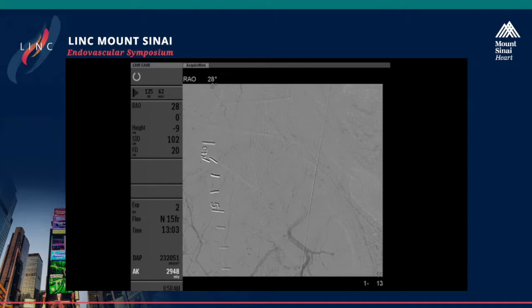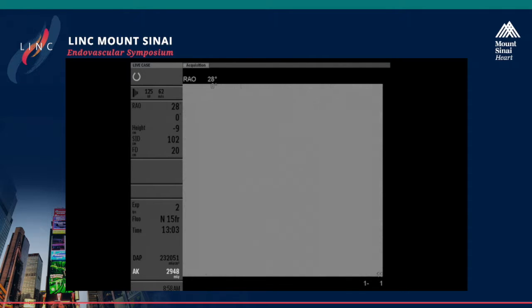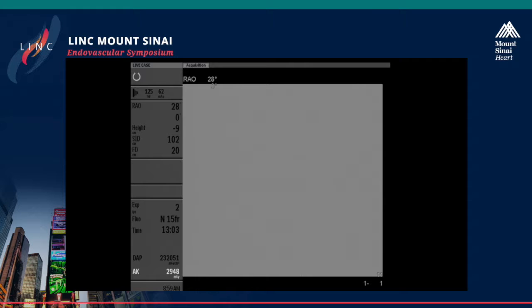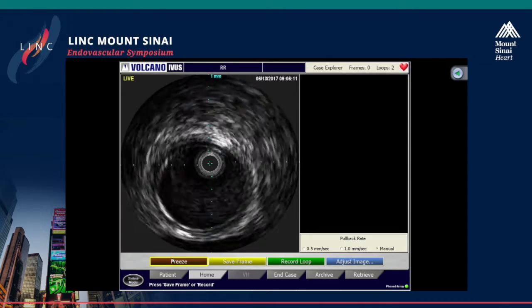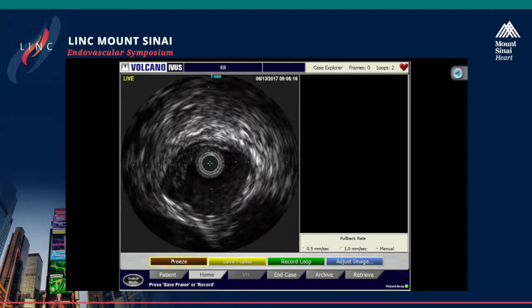And this is drug-eluting. Dr. Zeller published common femoral data, I think atherectomy, and it was just plain balloon angioplasty afterwards, right? With pretty good patency rates afterwards. And I don't remember what the follow-up was, how long that was. Well, I will show up-to-date data during my talk in a couple of minutes. The outcome is exceptional, and I believe it will be shown that we are equivalent with endovascular approach to surgery.